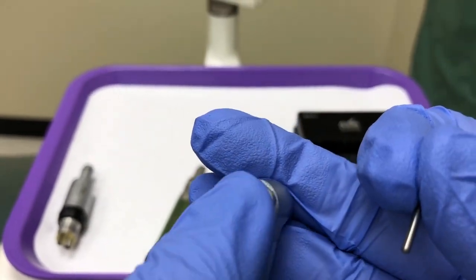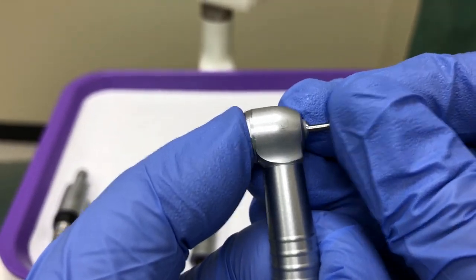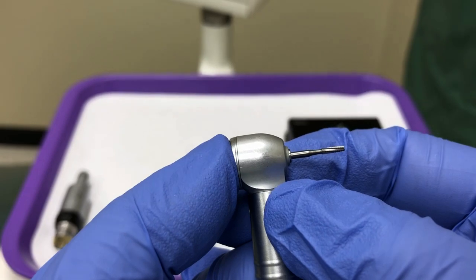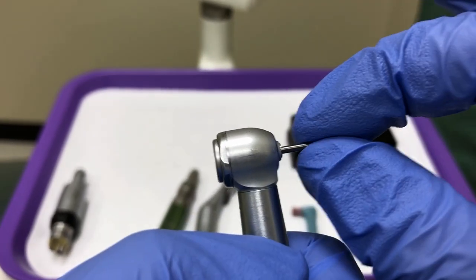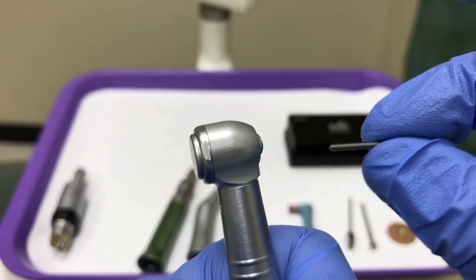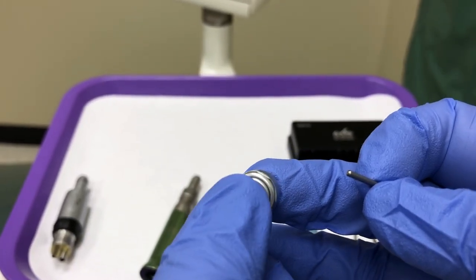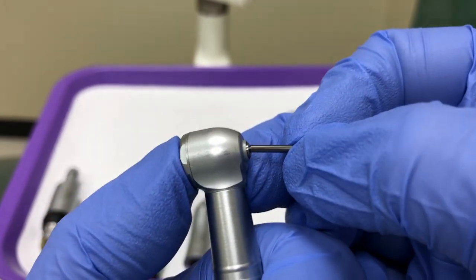This handpiece has a push-button lock. Push firmly on the back of the head and insert the burr. Always tug on the burr to verify that the burr is secure. If it comes out when you test it, it is likely to come out while the doctor is using it, and that can injure the patient. Reinsert the burr.